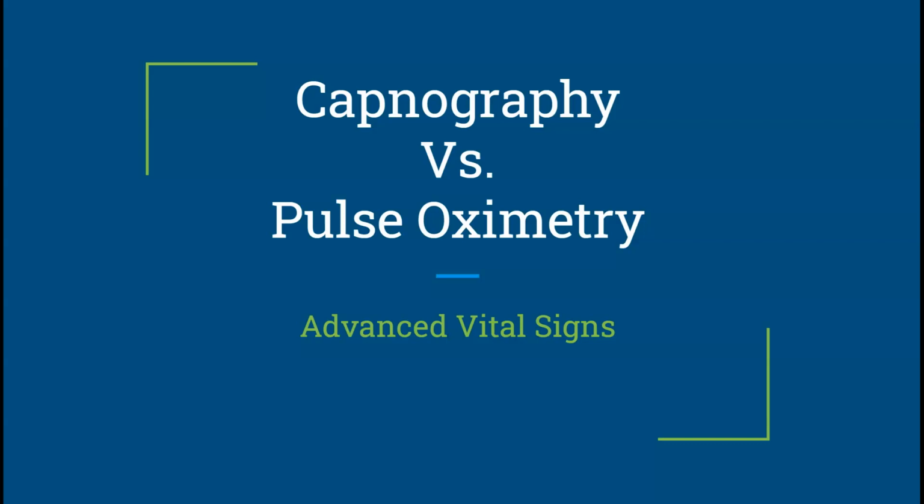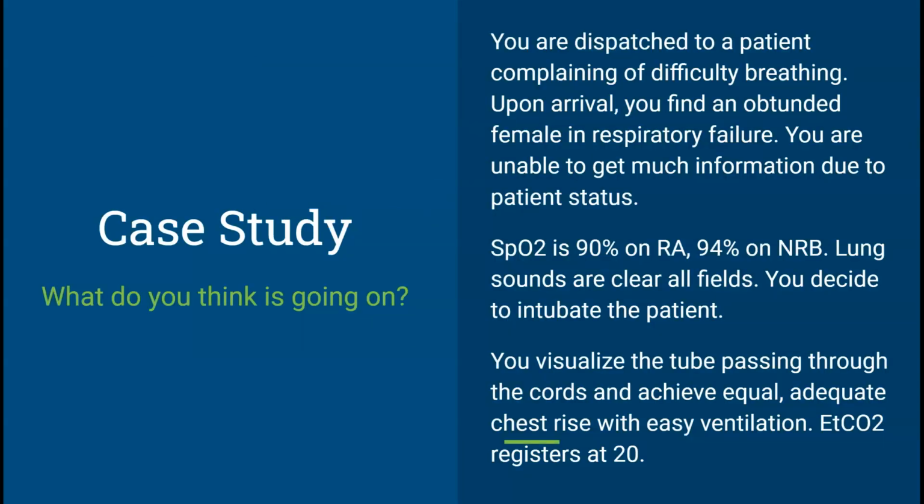So if you have a patient and you can't get a good waveform on the pulse ox, there's the concerns that, oh, maybe that they're cold, maybe they have nail polish on, or any number of those things. But if you take the blood pressure and it's very low, your pulse ox can confirm how poorly they're being perfused to the end tissues.